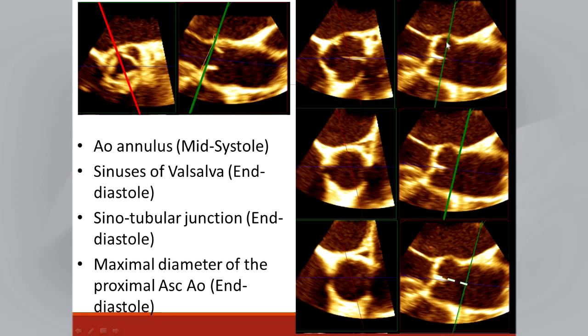You can see that inner to inner is different if you measure from this outer position to this inner position. The main reason is that inner to inner and outer to inner are not exactly the same.